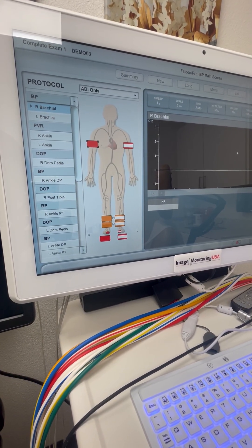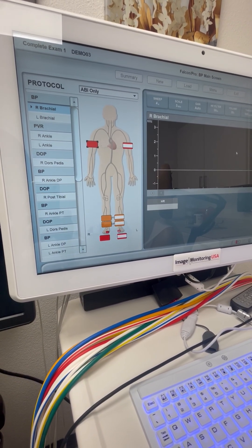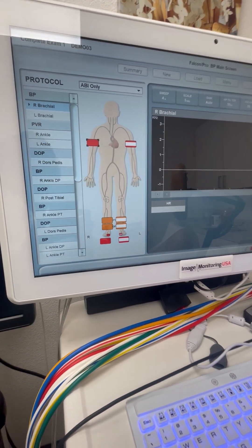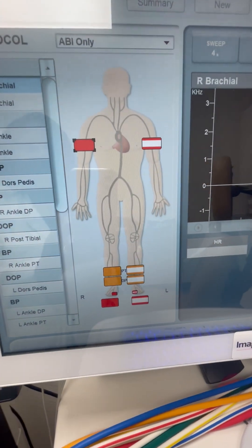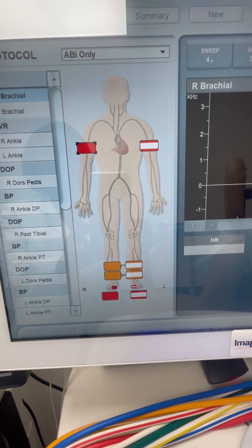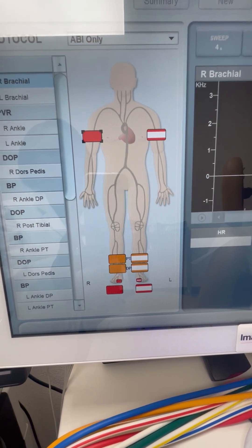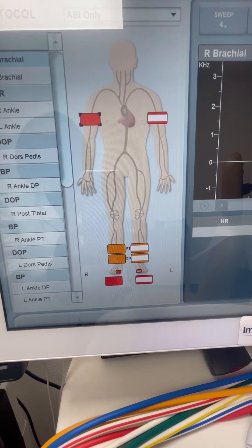This is our PVR machine that does the ABI test to screen for peripheral artery disease, or PAD. As you see here, what we do is we check the blood pressure of both arms, and we check two pressures on each leg.